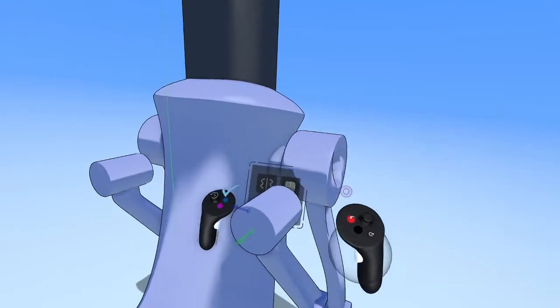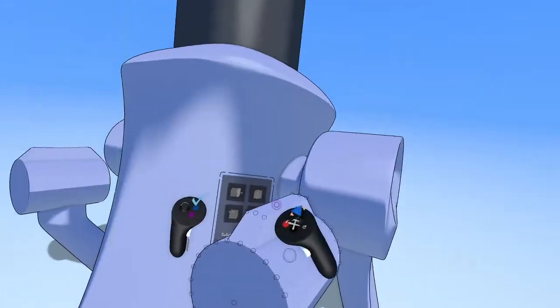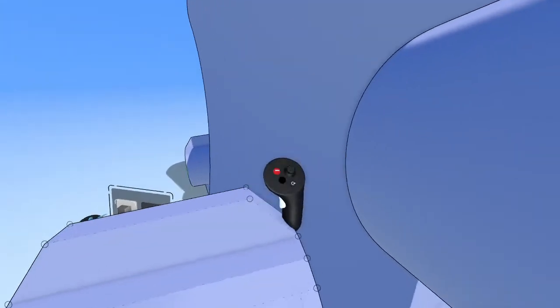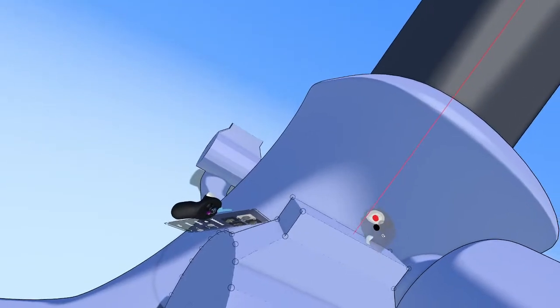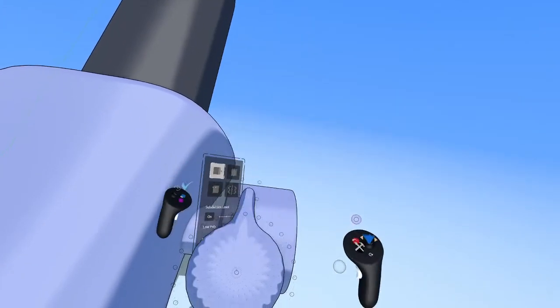All right, so let's build out the bit hand here a bit. So I'm going to come in here, duplicate this face out, and then use this option here, restrict face movement. And if I use that, then it will allow me to move exactly along the same direction of the face that I'm working with.